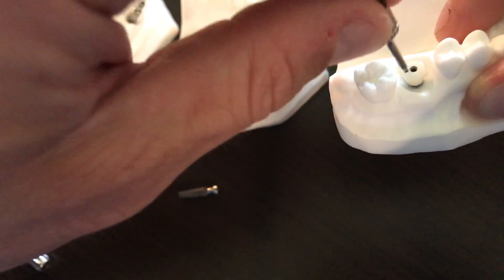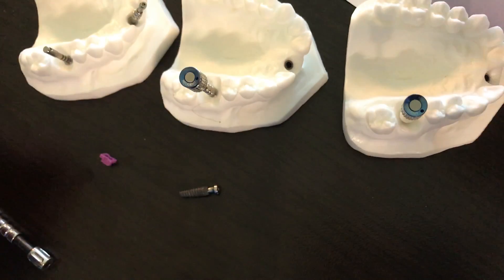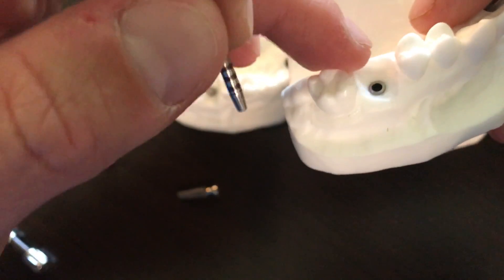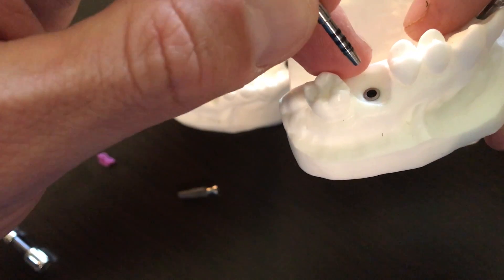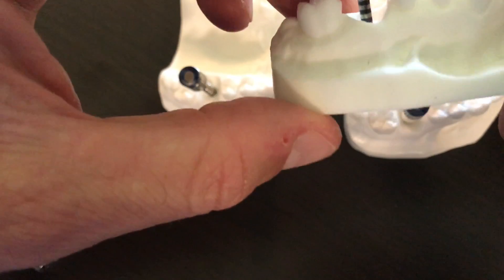We would simply remove that with the 048 driver — it's like a Brånemark or 3i — with this driver going on top. We take that off. We removed the healing abutment and used this tissue measurement gauge, so this can go in. It's just a nice little friction fit.